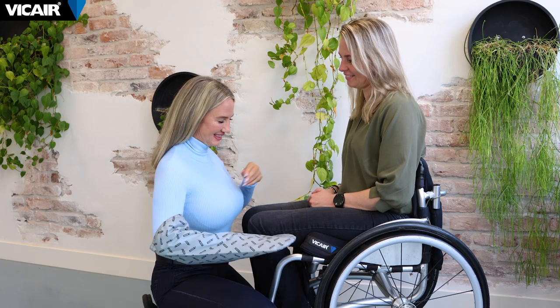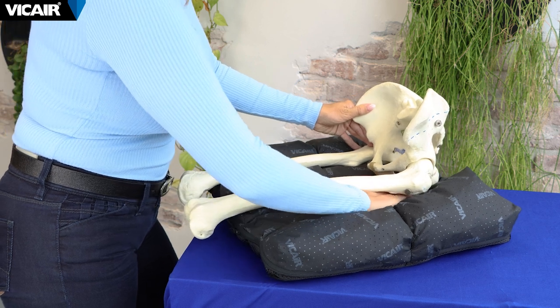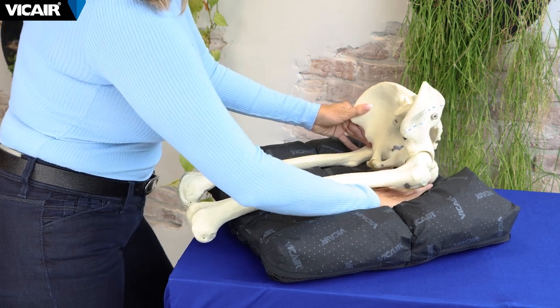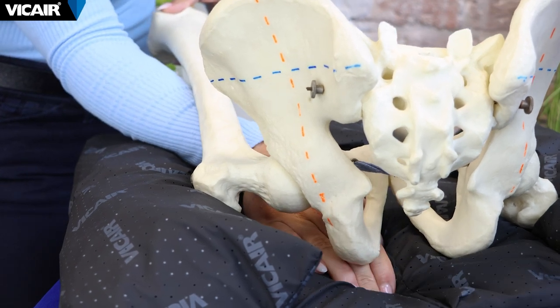Options for checking if a client is bottoming out are as follows. You have access from the front by sliding your hand following the natural line of the femur until you reach the ITs. If needed, lift the knee to make the ITs more prominent for palpating.